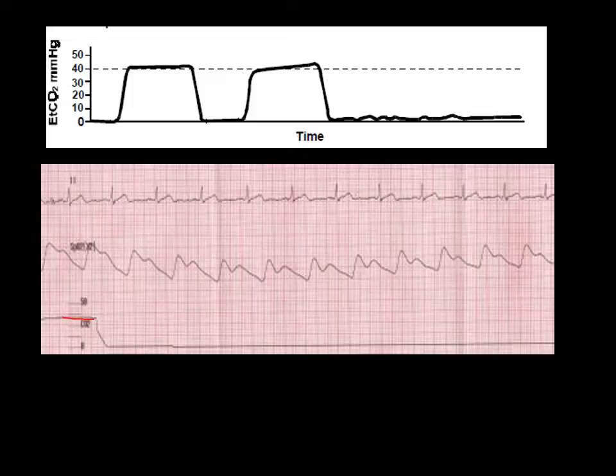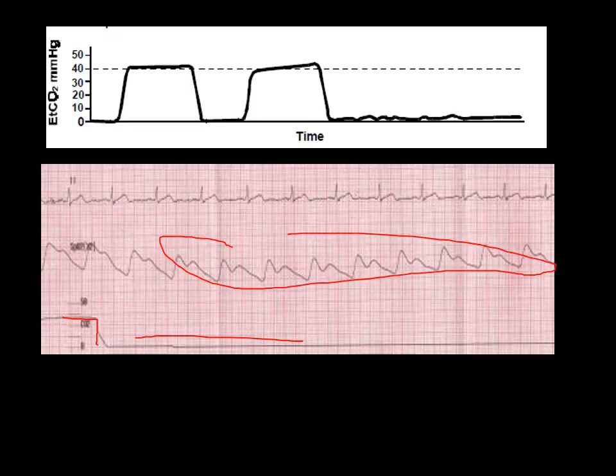And then you see the wave, and then nothing. If you notice, the SpO2 is the same. He still has a pulse, but he just stopped breathing.